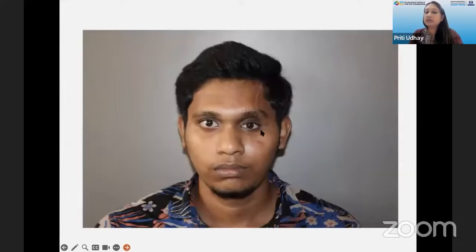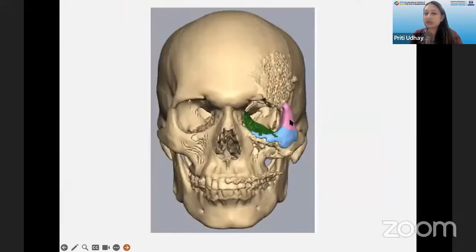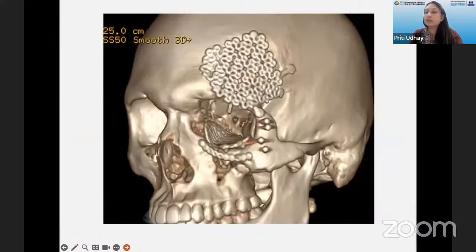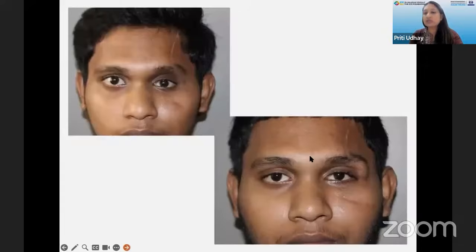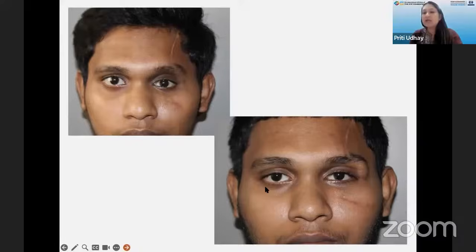Now, another patient, again, the midface is flattened here because the zygoma is malunited. He also had neurosurgery before. You can see all the four walls are fractured here. Again, we have designed a PSI for the rim, and the floor and the medial wall was corrected by Medpor coated titanium implant. You can see the implant here, and this is how the PEEK looks like. Post-operatively, PEEK will not be seen on the CT scan, but titanium is seen well, and you can see the midface has improved very well. And this deformity is there because of the temple hollowing, which we will do a fat graft later.